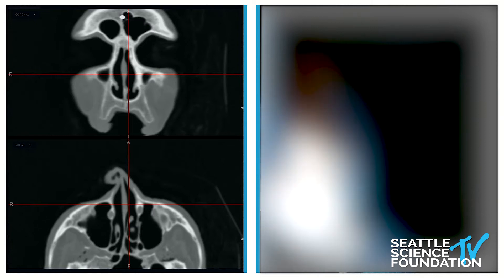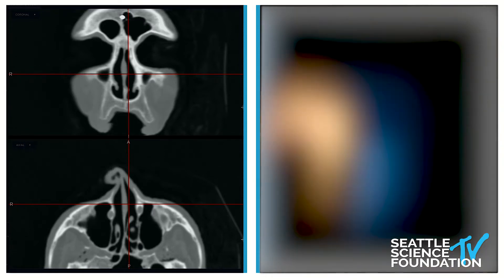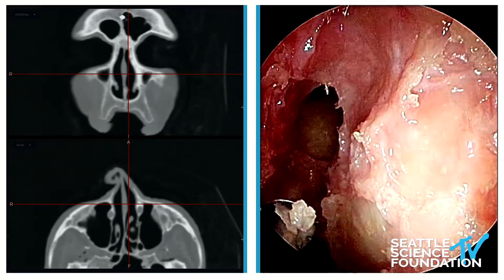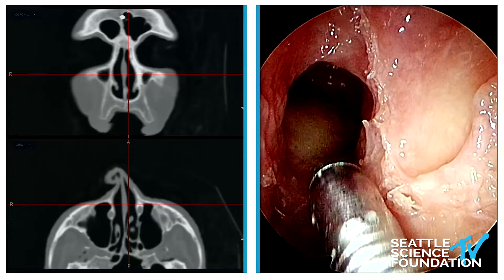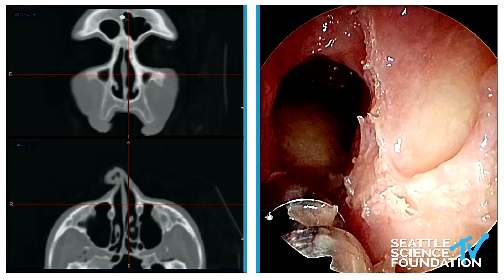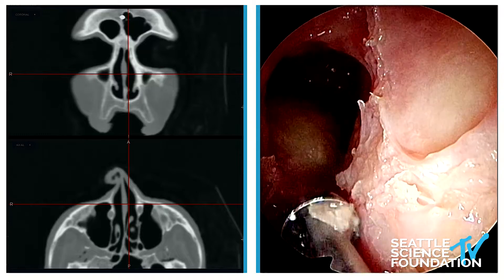If anybody else wants, I'm going to start fresh on the other side and can just hang out at this station. But I'd also encourage you guys, if you'd like to, to be at your station to practice what Winston showed you. Practice looking with angled endoscopy into the frontal sinus to get views like this one. I'll be here just doing the opposite side so we can do the complex cellularity of the frontal sinus on the opposite side.